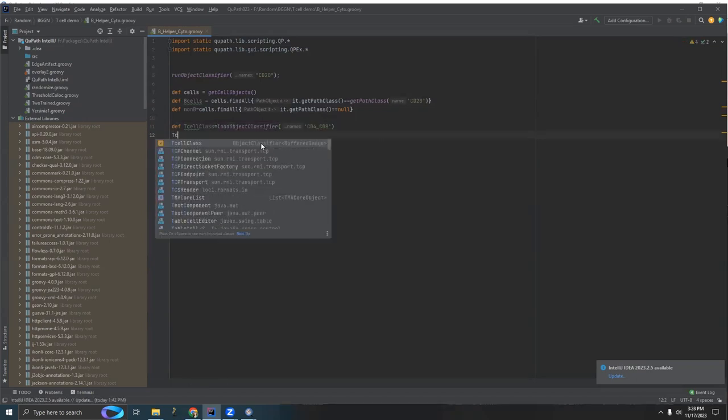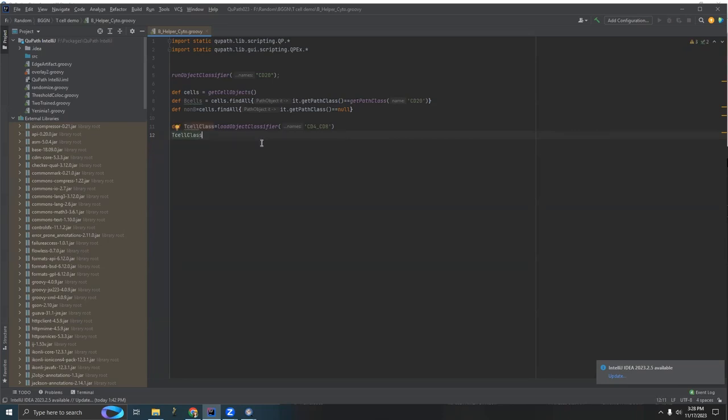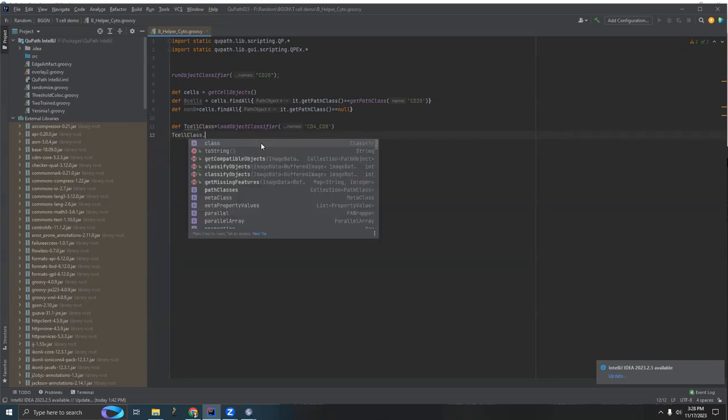Okay, now that I've loaded the classifier, I can call it again. And hit dot, and IntelliJ suggests some things that I might want to use. And in this particular case, I want to use classify objects. And there's a couple of different types of classify objects, which you can see as I'm highlighting here. One just calls the entire image data, which is basically everything that's going on in this file. But the other version, if I hit down, calls image data, but also calls a specific collection of path objects. And that's the one I want to use.